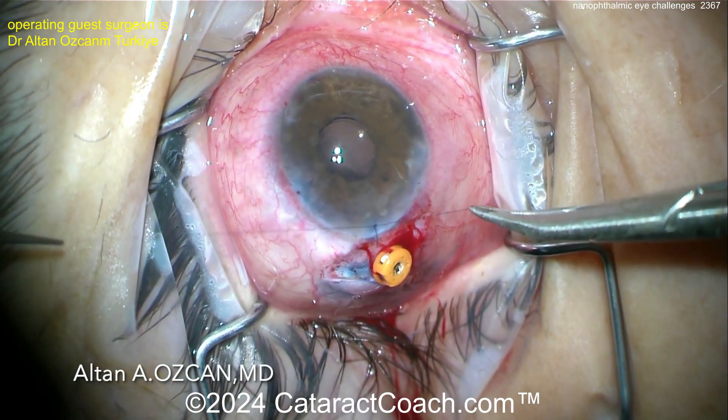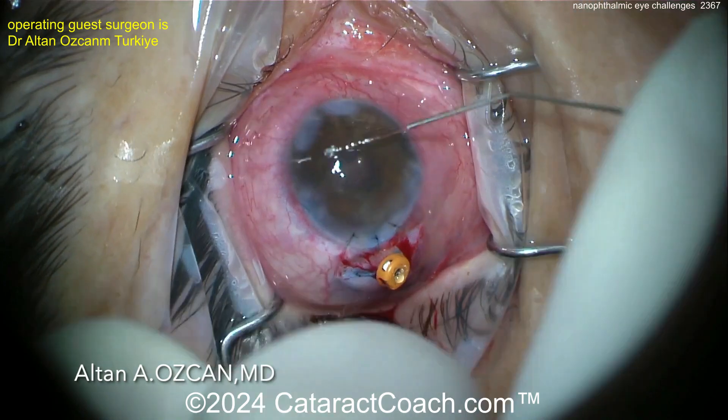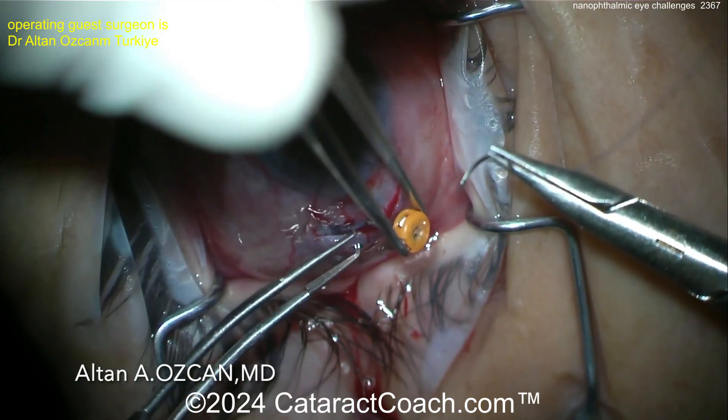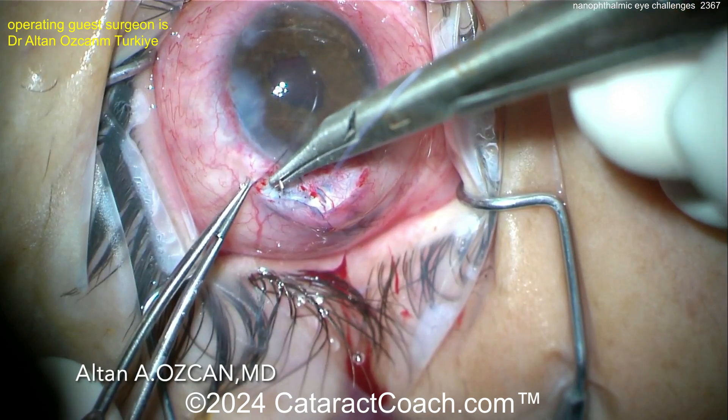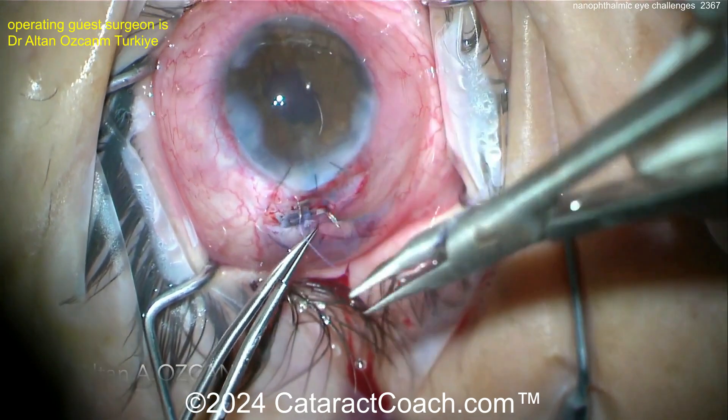Now sutures — looks like 10-0 nylon — suturing up that incision. I'd probably suture that sclerotomy site too. Take the trocar out. For that one, you're probably using a vicryl suture. Then let this patient have some time to heal up.